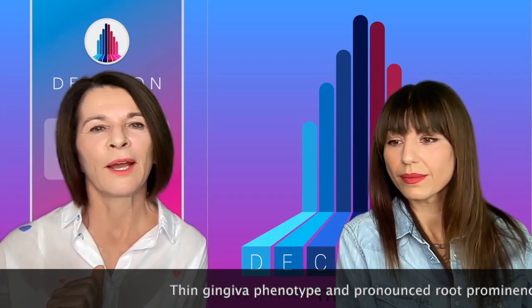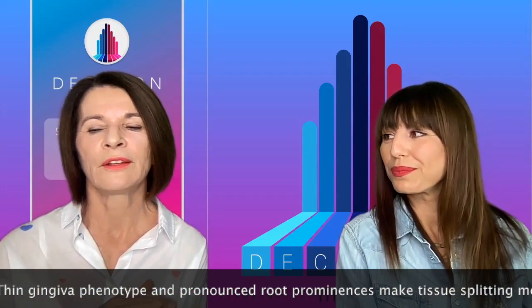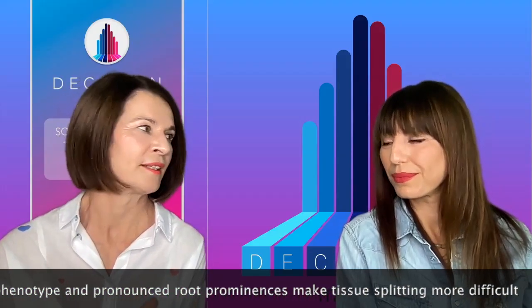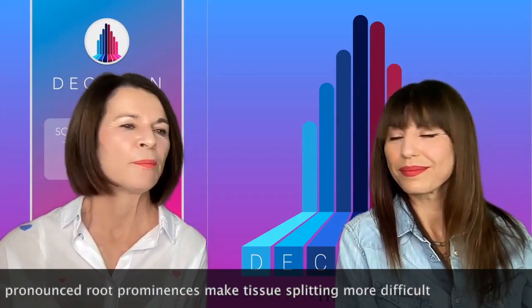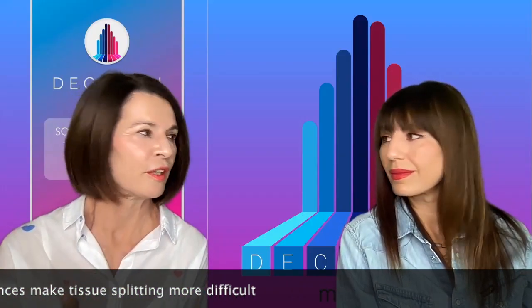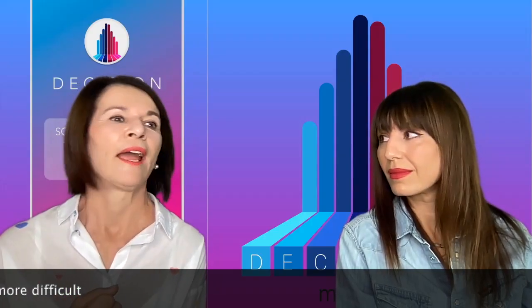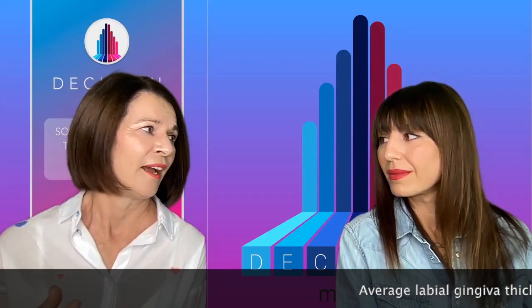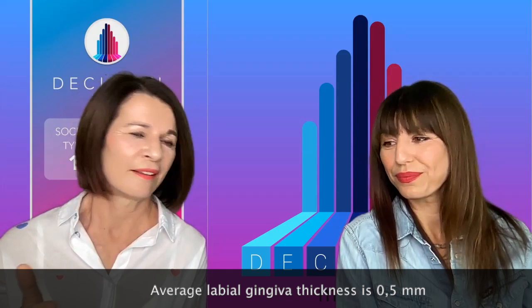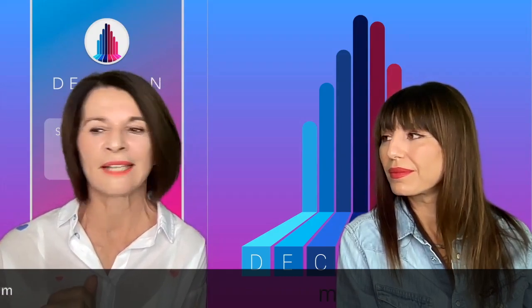But if I'm honest, I often felt the bone underneath my blade, especially if the juga are more pronounced, especially if the patient phenotype is thinner. The average labial gingiva thickness is 0.5 millimeter, so of course you sometimes come to the bone.